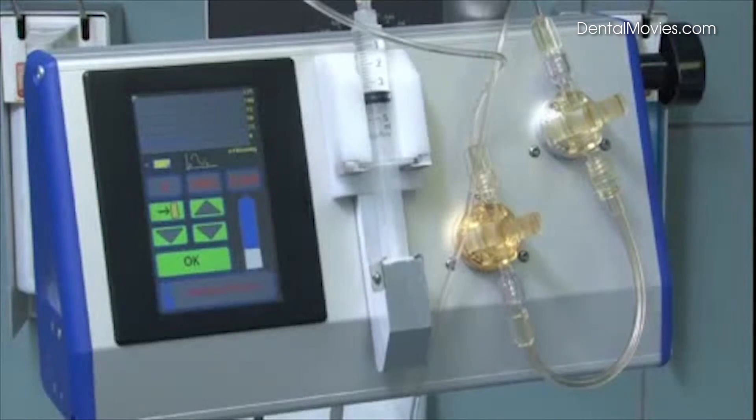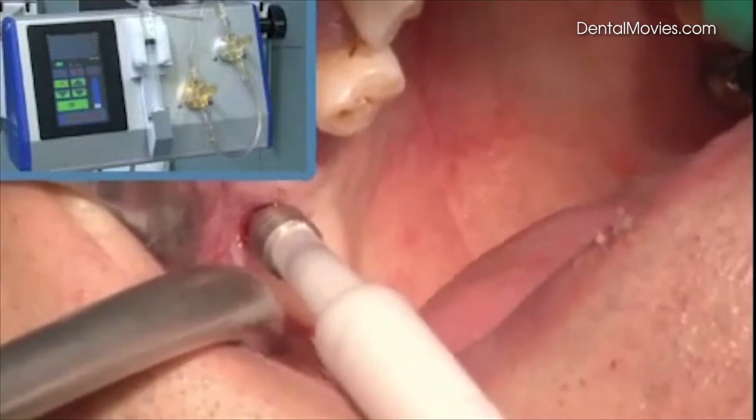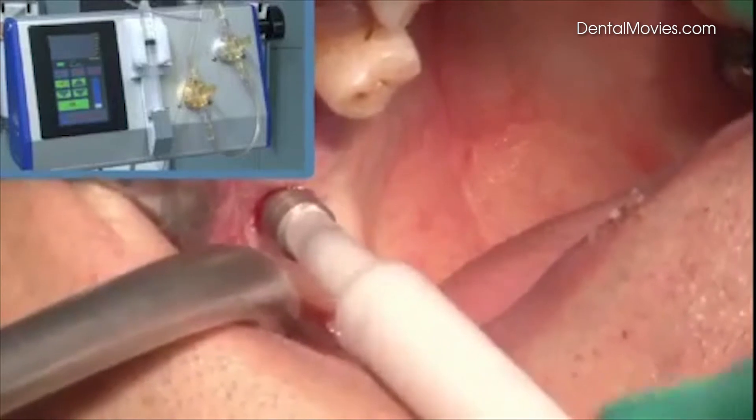When the membrane is sufficiently lifted, the saline solution is extracted using the Jader pump. The bone grafting material is inserted. Since the bore is narrow, a paste-like bone grafting material, for instance Ostim, is used.